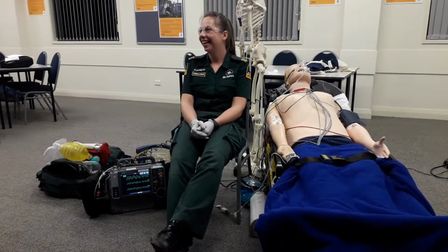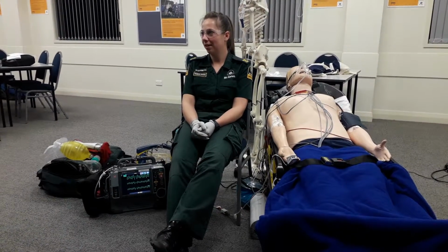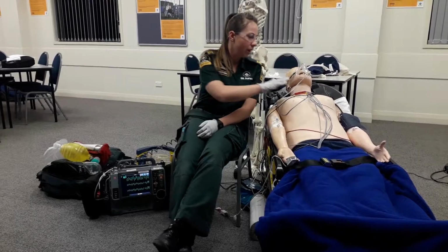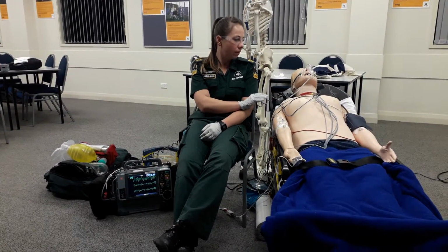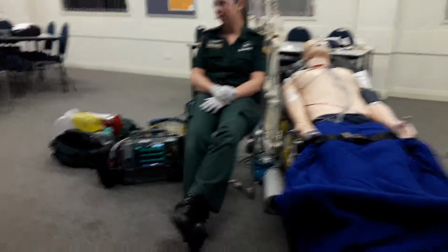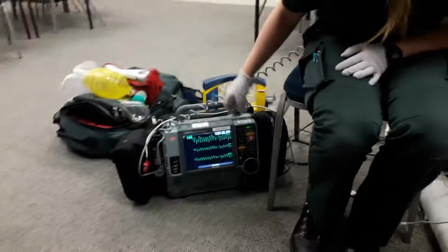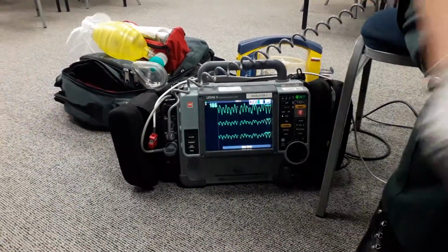Place pads in either apex sternum or anterior posterior position in addition to the ECG electrodes. So as we can see, apex and sternum pad placement, ECG is also in place. Ensure the defibrillator is in manual mode. The defibrillator is in manual mode, as we can confirm.